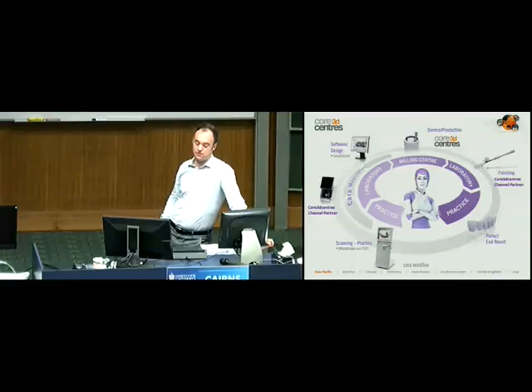So if you do see anyone from Heraeus, certainly ask them about it, or certainly Google it. It's called Cara. And the scanner itself is very nice. It uses a parallel confocal technology. It looks a little bit different. It looks more like an impression gun, and it's got a touch screen, and it looks very space age. It has its positives and negatives. I've yet to really use one in anger, and I'm looking forward to using it. But whether it's the iTero, whether it's the Trios, whether it's something else down the line, this technology is here, and it's here to stay. So it's definitely worth starting to ask the right questions now rather than later.